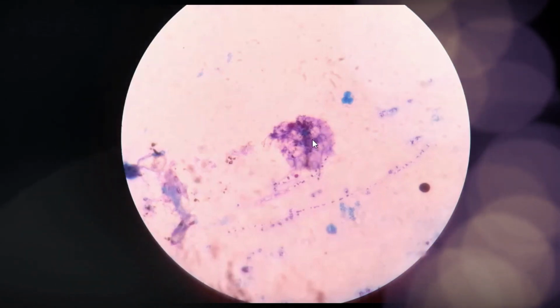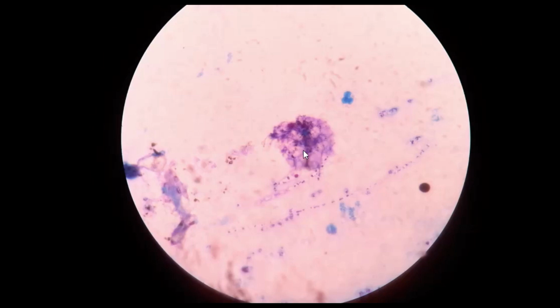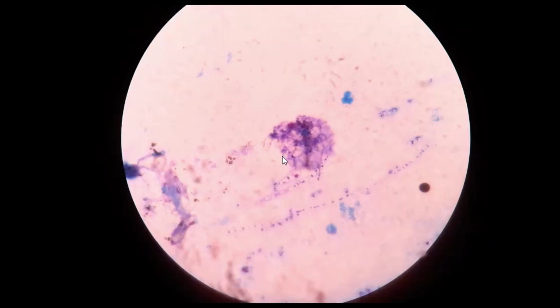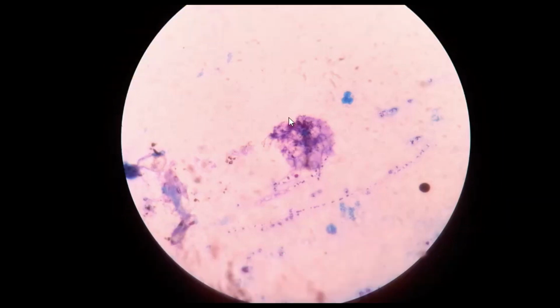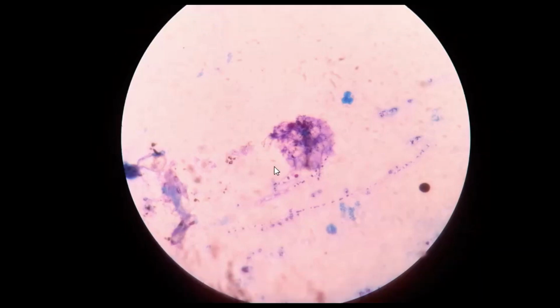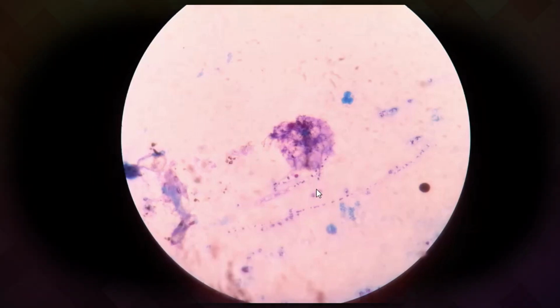A clinician checked a 75 year old male patient having signs and symptoms of pulmonary tuberculosis and thus advised him to provide sputum for acid fast bacilli stain. No acid fast bacilli were seen, but there is a structure resembling Nocardia observed, and that is why modified acid fast bacilli stain was performed for Nocardia.